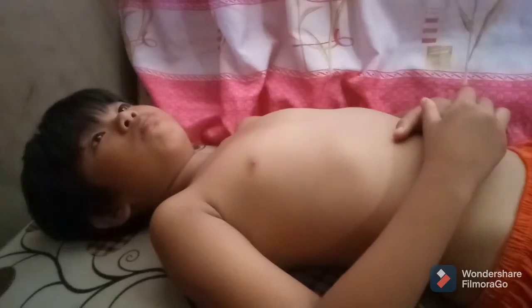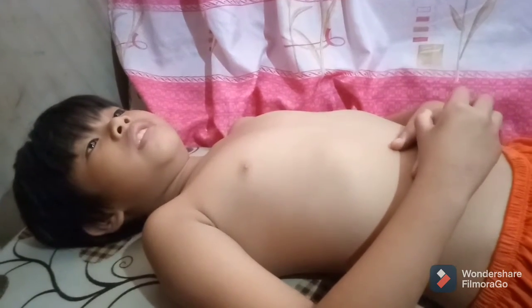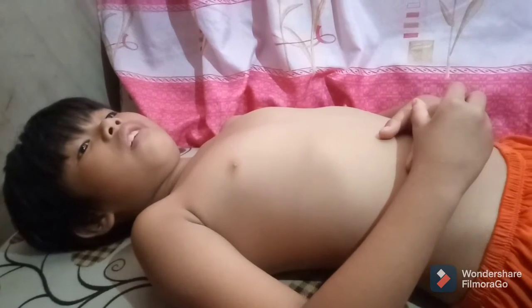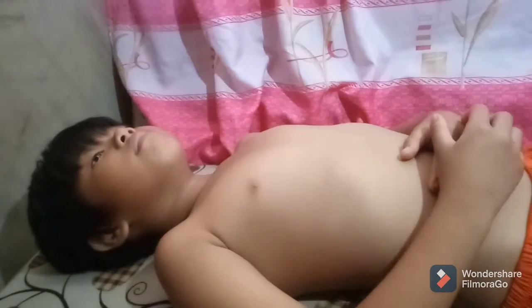In patient positioning, the patient must be supine and aligned with the midline of the table and grid. So the head of the patient must be positioned at the midline of the table grid. In part positioning, position the head with no rotation. As you can see, the patient is positioned in a supine position. Then adjust the chin so that the orbitomeatal line or OML is perpendicular to the IR. Adjust the chin, that's the correct position.